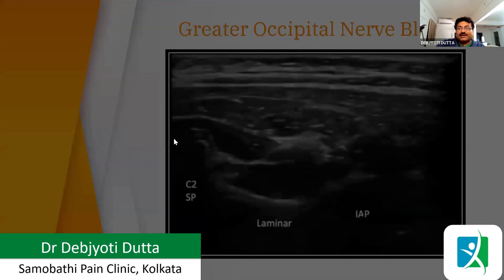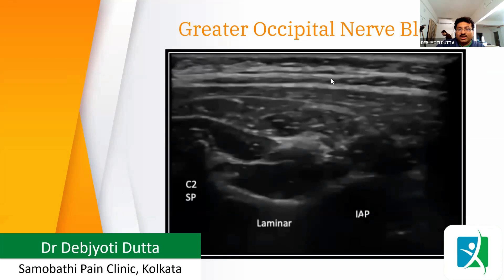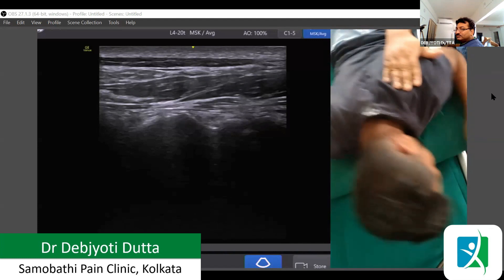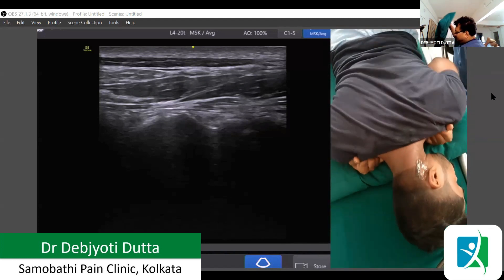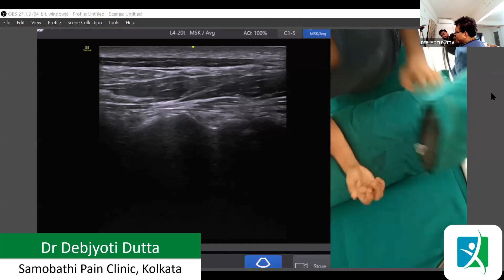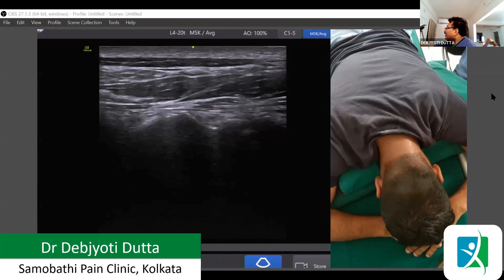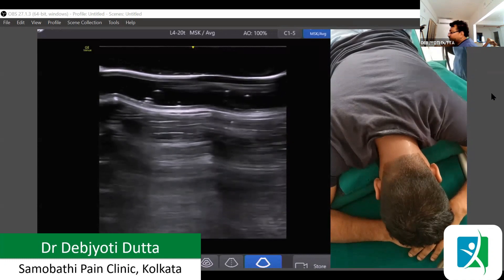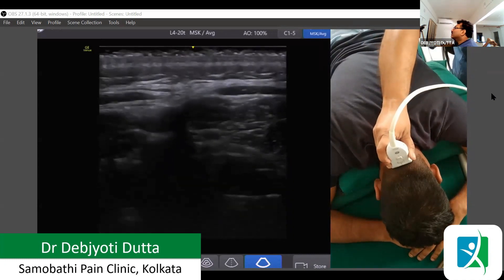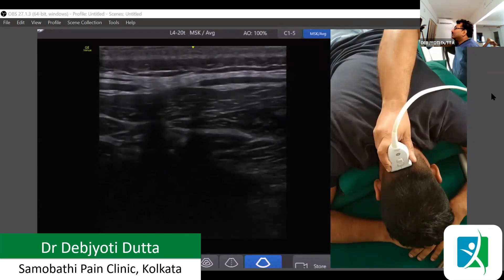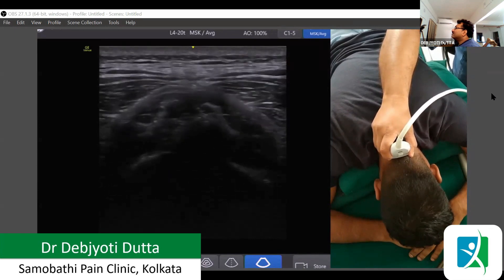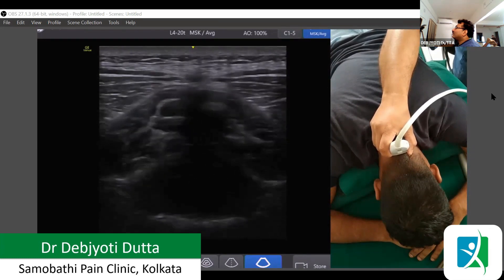For the greater occipital nerve block, let me show you on the volunteer. A pillow is placed below the abdomen to stretch the neck. We start from the occiput and come down from the occipital bone, moving downward along the spine.